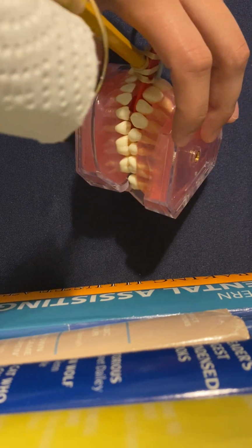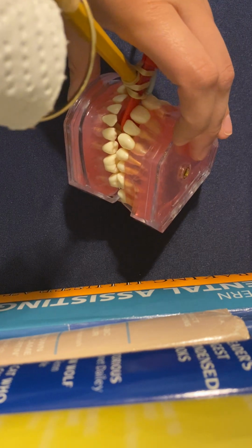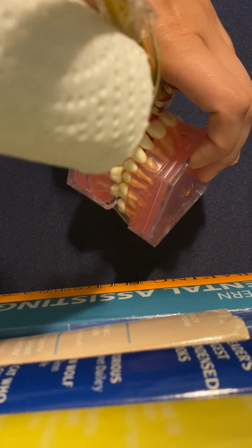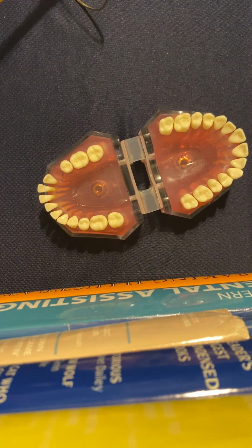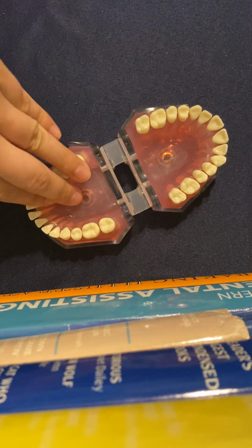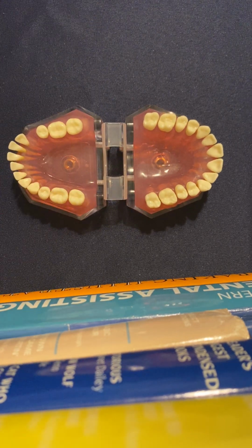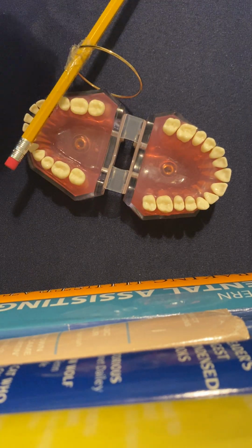And where you see my finger, I would assume that'd be more of the outer part of the eye, maybe right here, which is kind of where you want to line that up. And you're going to want to point down from the pupil of the eye to the occlusal plane. So definitely like that. And then number 18, the final in our series, would be the bite wing left molar.